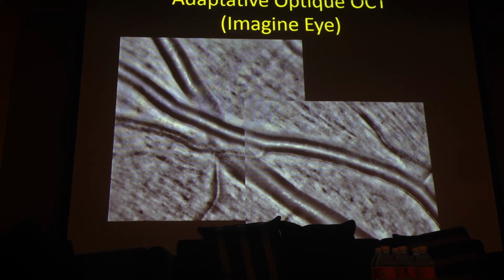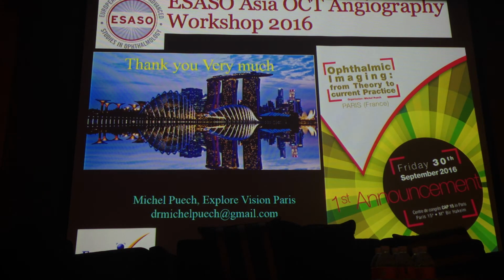This new technology arrived in our current practice with just a few machines, but the evolution of technology will push it into every big center at the beginning, and probably into many other centers after.